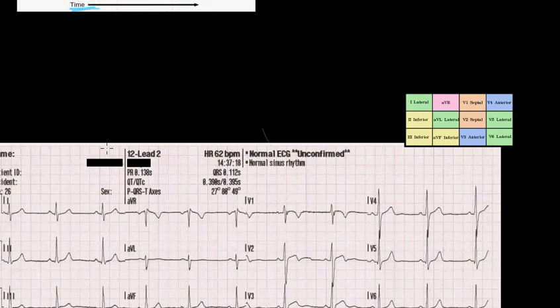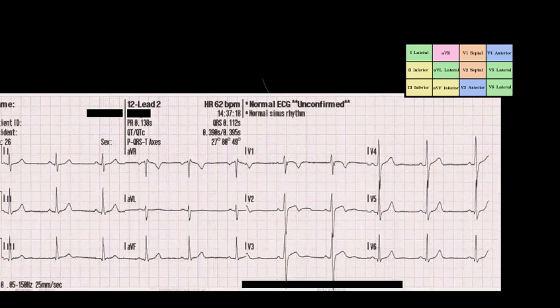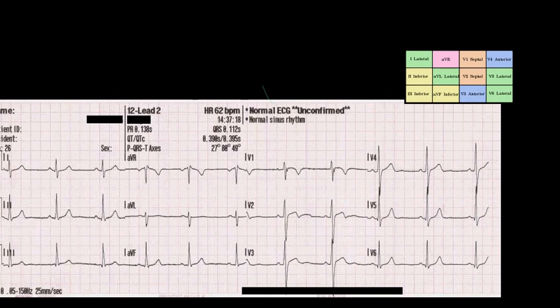Now, let's come down here and actually take a look at one of our standard 12 lead EKGs. Now, before reading an EKG, it's important that you have a system, because the system will help keep you organized every time you review an EKG. The system I was taught was first determine the rate, then the rhythm, then evaluate your intervals, so the first three important steps.